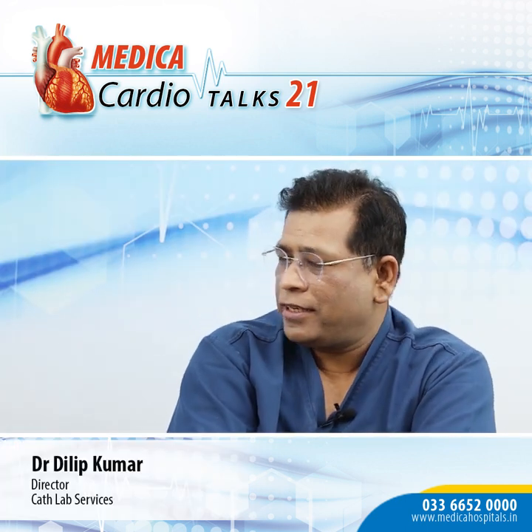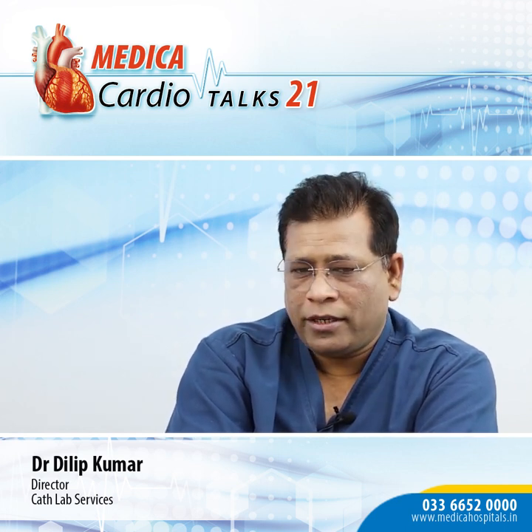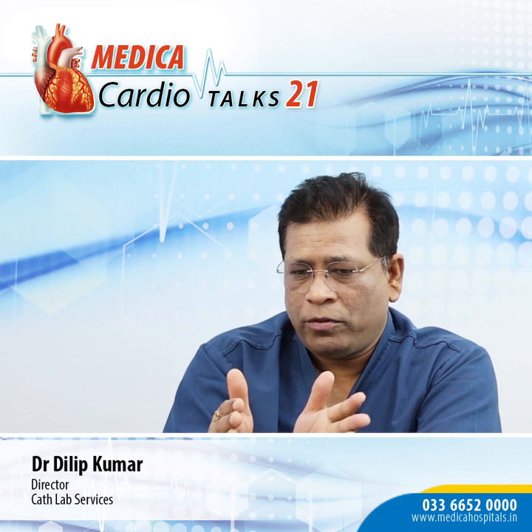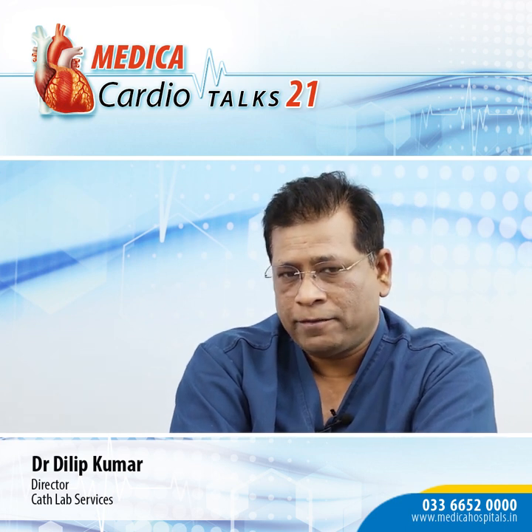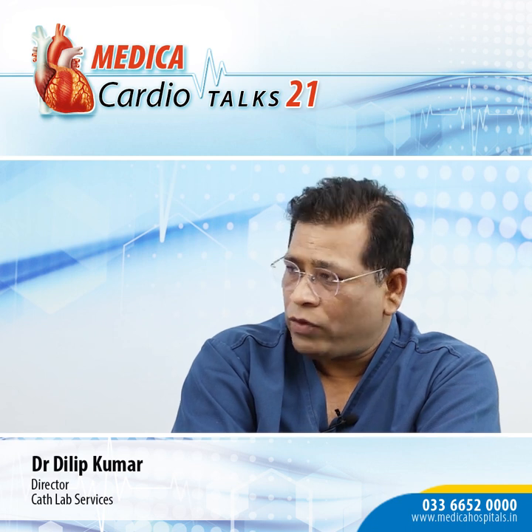And we are really moving towards a very exciting phase of structural heart interventions. And the tricuspid valve has a very special place. Everyone who has more than moderate TR is going to have a very bad prognosis, and the survival rate of significant primary TR after 5 years is something around 48%.